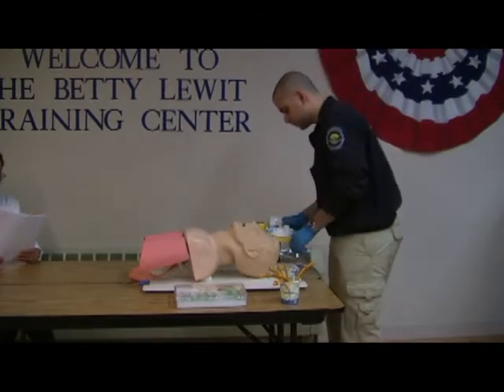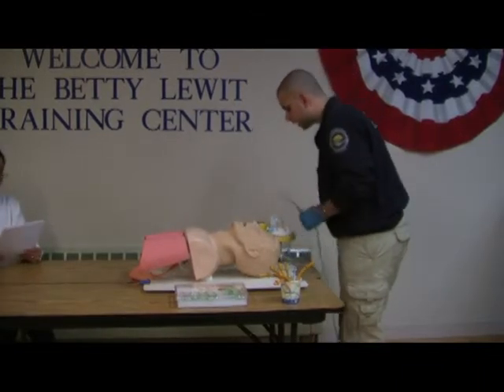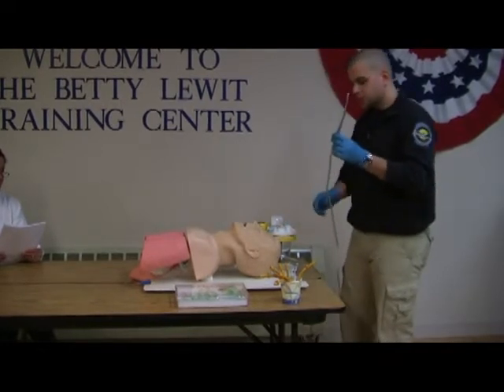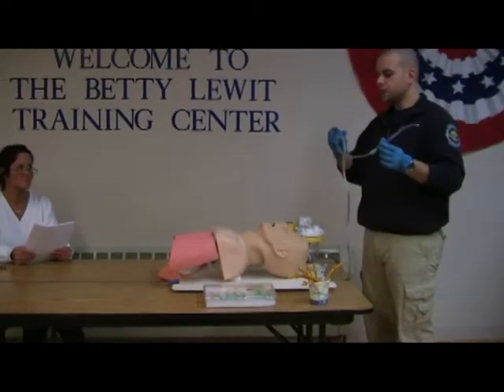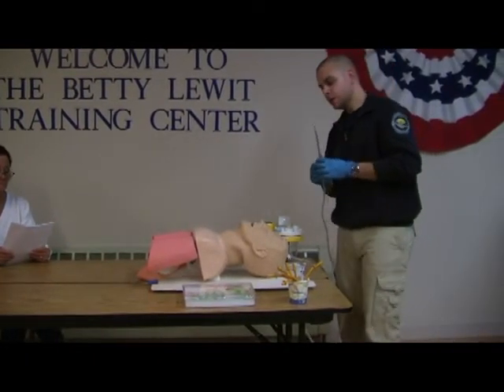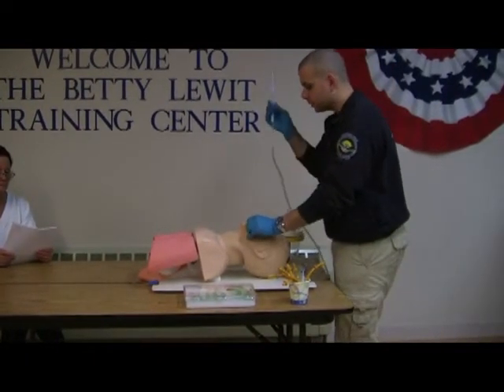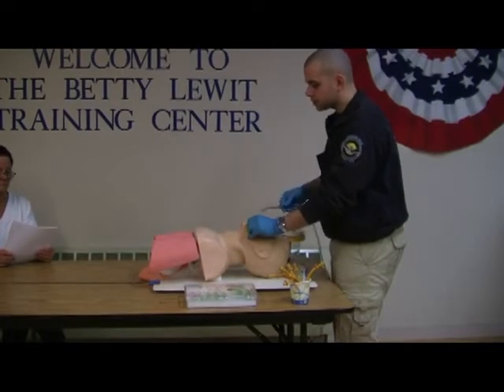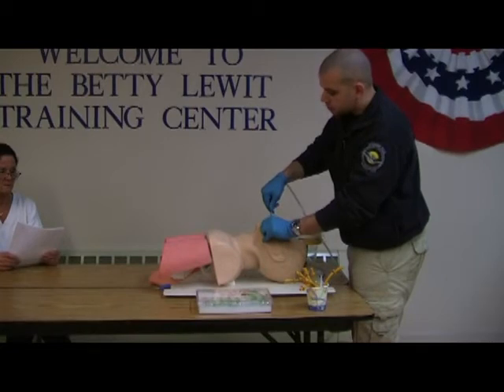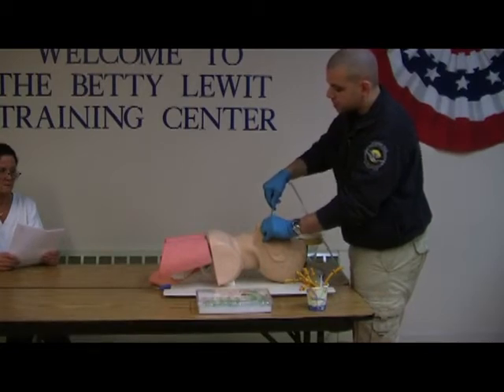I am going to take my suction device, make sure that the catheter is attached to it, and turn the device on. I am going to test for its function. The device is functioning. I am going to open my patient's airway. I am going to insert the catheter without suction, then apply suction for no more than 15 seconds on the way out.